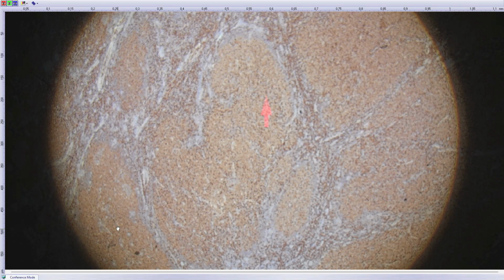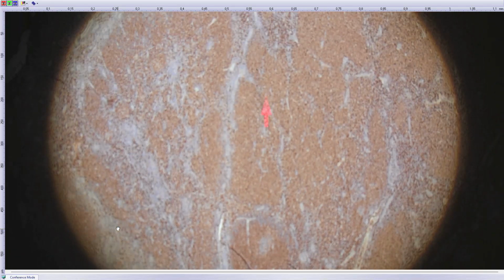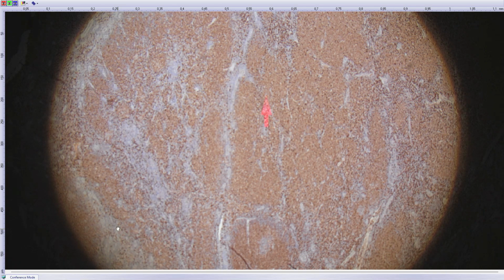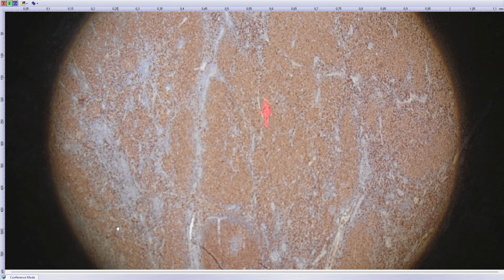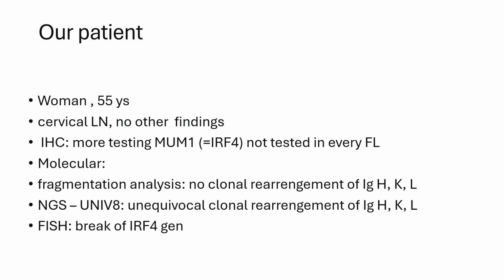The nice slide actually, which you have to see because it's really, really beautiful. This is a remarkable stain for IgL lambda light chain, and here you can see just spectacular restriction, right? You can see the fully differentiated plasma cells positive for lambda, and also a little bit weaker but still strong enough expression in the large B cells, right? And on the next slide, please. This is like an additional finding, but it's a beautiful thing to see.